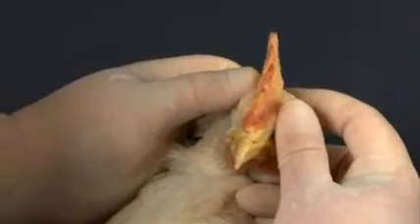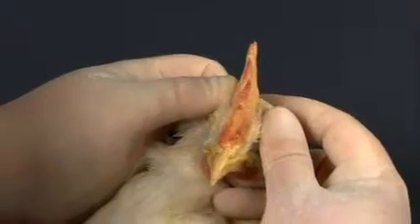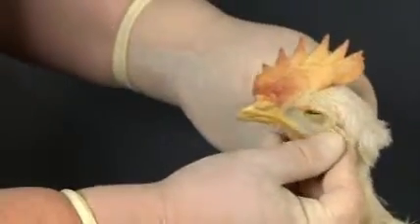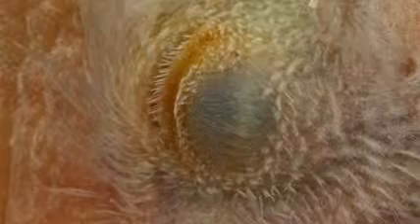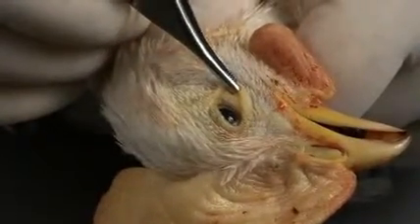Palpate the skull for fractures and other abnormalities by wrapping your fingers around the base of the skull and running your thumbs up and over the crown, around the orbits, and under the beak. The eyelids should be clean, dry, and free of exudate and adhesion. Open the eyelids and inspect the eyes.